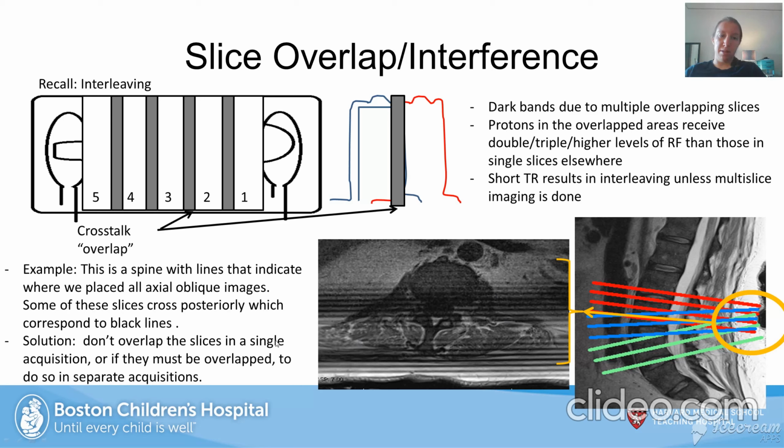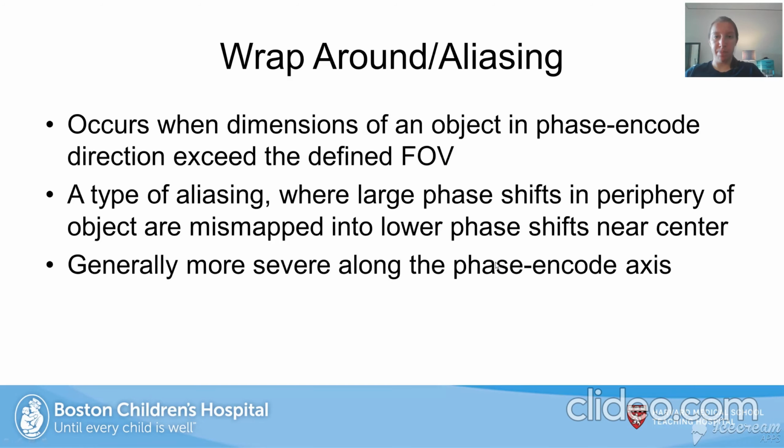So the solution is just don't overlap the slices if you can in a single acquisition, or if they must be overlapped, do so in a separate acquisition.